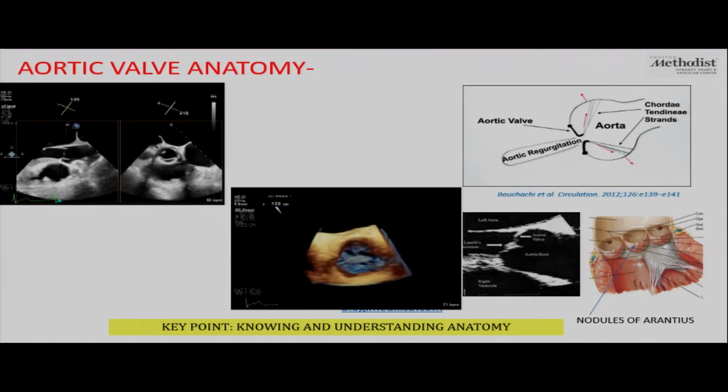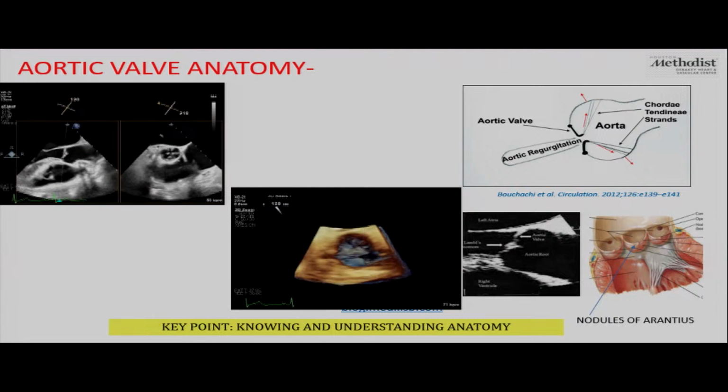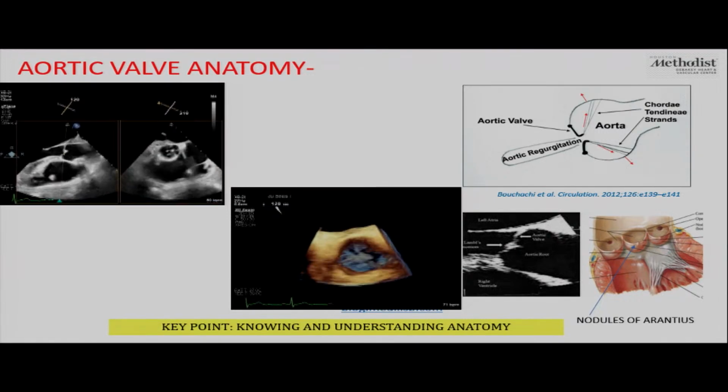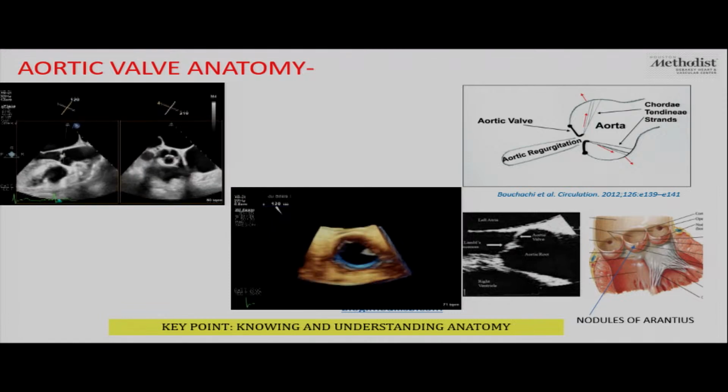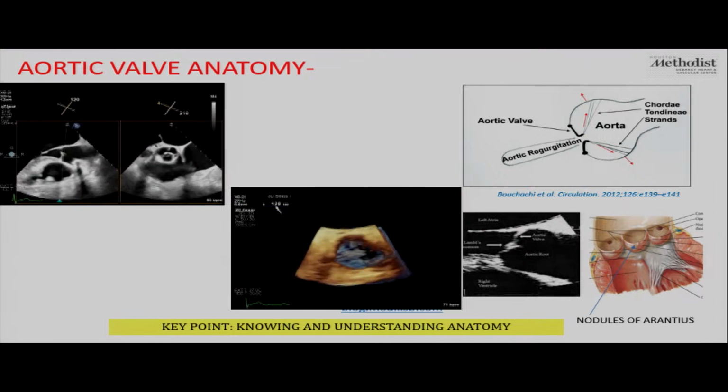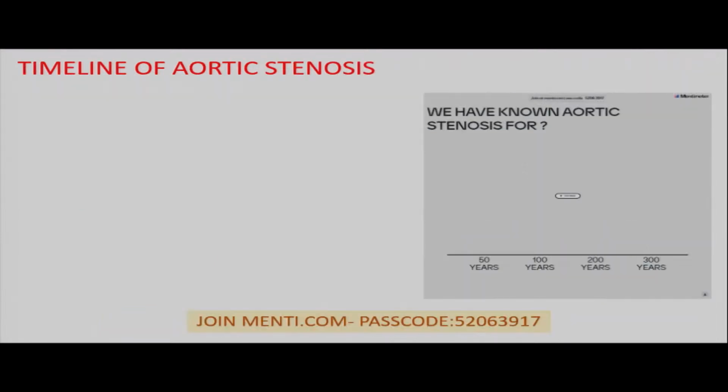And one more mention, I'm sure every one of us has seen this as well, which is basically aortic valve chordae, which are nothing but embryonic remnants, but more recently have been recognized to cause tenting of the valve and also causing malcoaptation and aortic insufficiency as well.